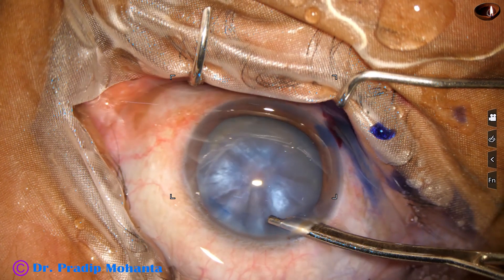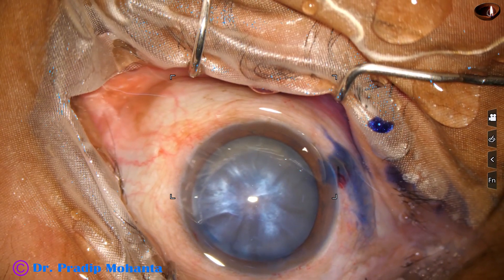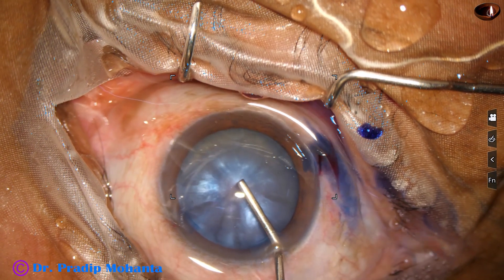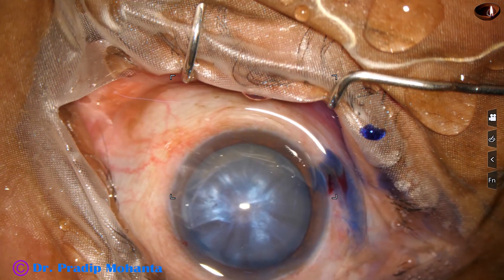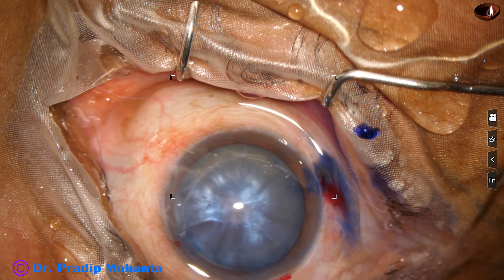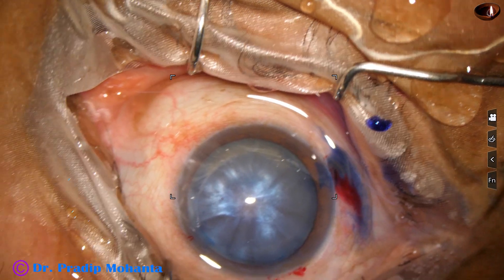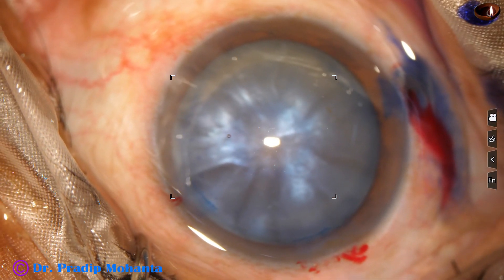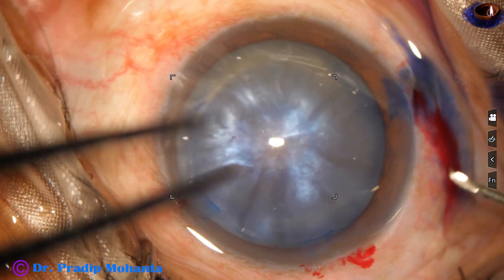We can see some water pockets just underneath the anterior capsule, looking like a cycle-spoke pattern. This indicates that it is an intumescent cataract.